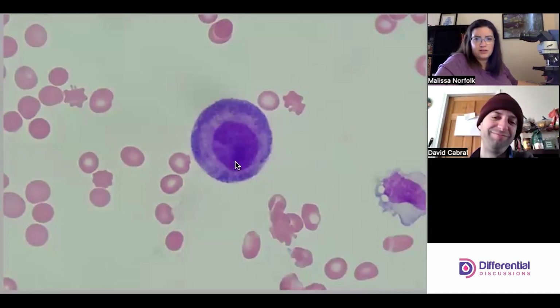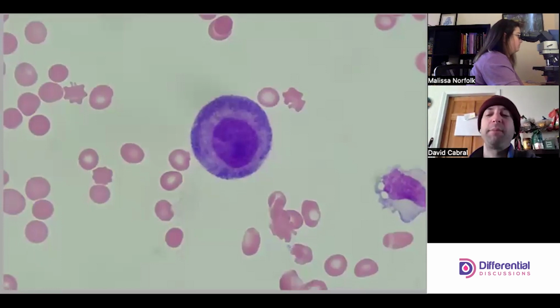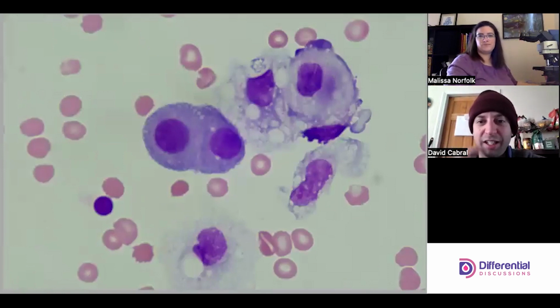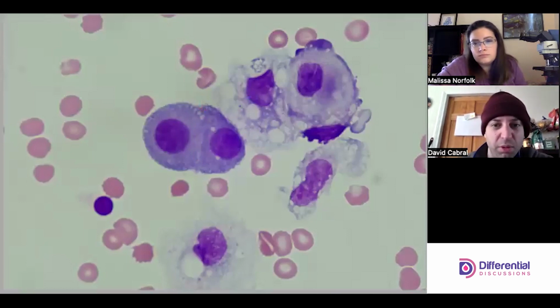And then if you look at the nucleus, we got this nice big dark spot there. That's not normal, right? You have a light spot over here, which I guess could be the nucleoli, but mesos typically are pretty uniform on the chromatin pattern. That's a great point. Sometimes I'll know the category I want to put it in, and it's not entirely easy to articulate. So this is a good window. That's more of a normal window to see. So I don't know, what do you think?